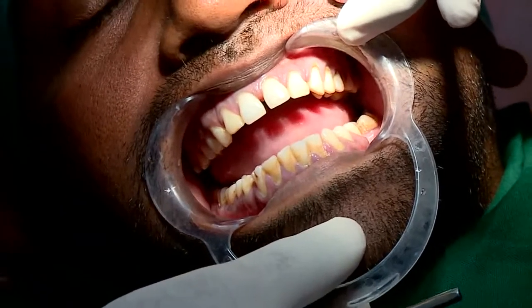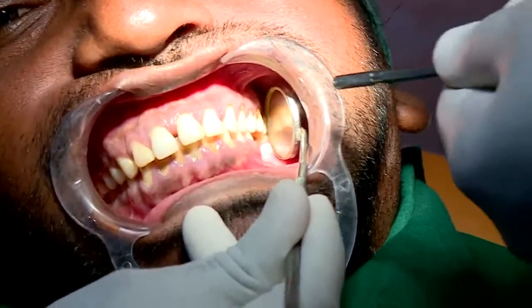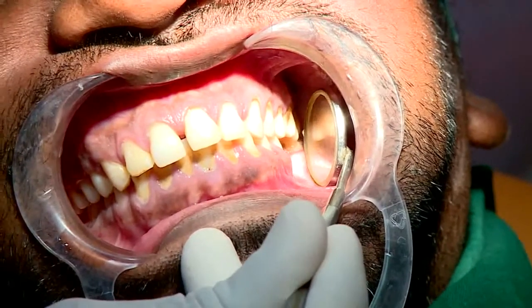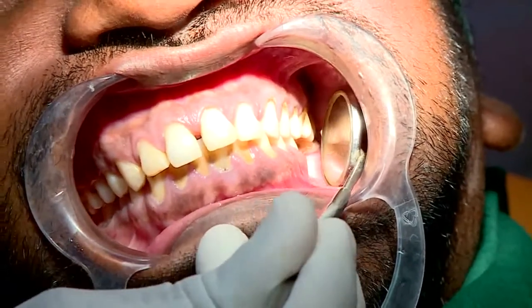If you can see in the mirror, there is an adequate amount of space there for us to place a tooth. The supraeruption is minimal.